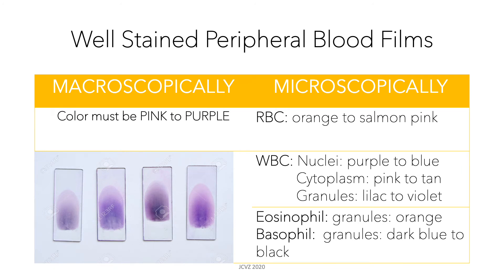How would you be able to tell if you have a well-stained peripheral blood film? Macroscopically, the color should be pink to purple. When you look at it under the microscope, red blood cells should appear orange to salmon pink, while white blood cells should have purple to blue nuclei and a pink to tan cytoplasm. Granules should be lilac to violet, eosinophils should have orange granules, and basophils should have dark blue to black granules.